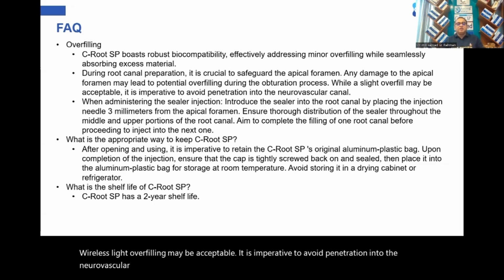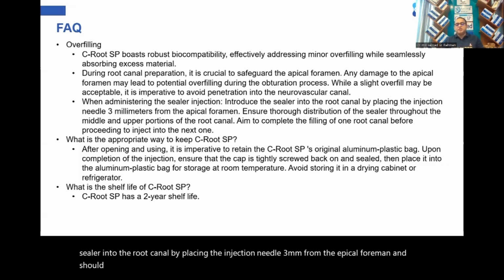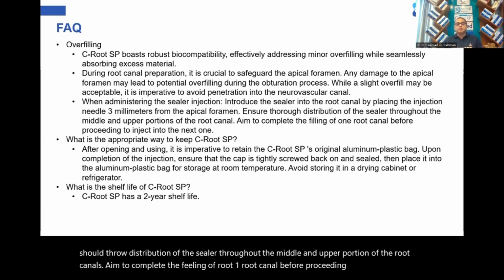When administering the sealer injection, introduce the sealer into the root canal by placing the injection needle 3 millimeters from the apical foramen. Ensure thorough distribution of the sealer throughout the middle and upper portion of the root canals. Aim to complete the filling of one root canal before proceeding to inject into the next root.